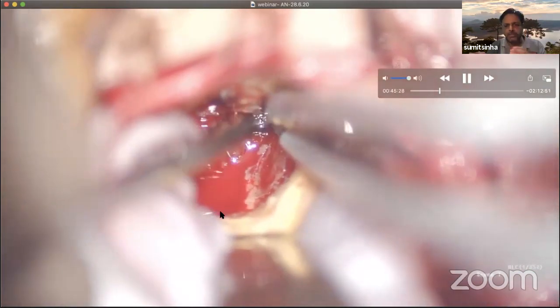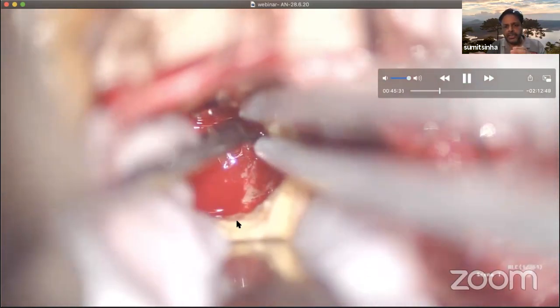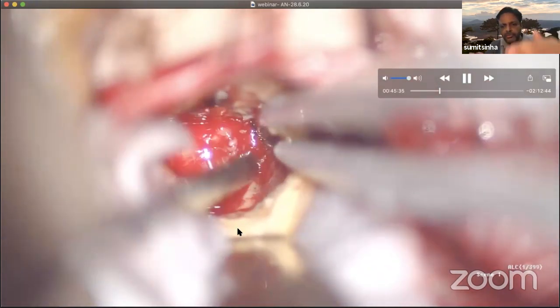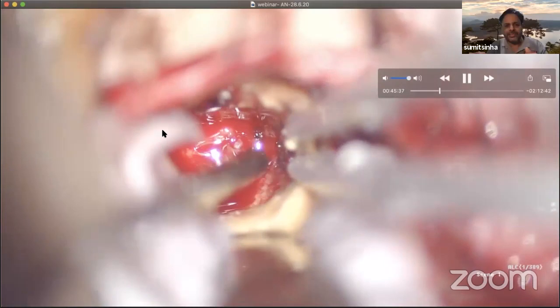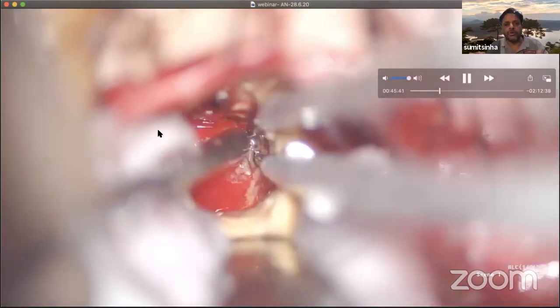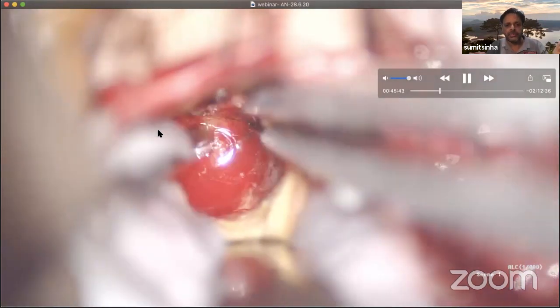And then I go on to the medial side and decore it from here so that I can separate the tumor capsule from the brain stem. And then lastly, my pattern is to decore it from the upper pole, because it is here that you will encounter the trigeminal nerve.